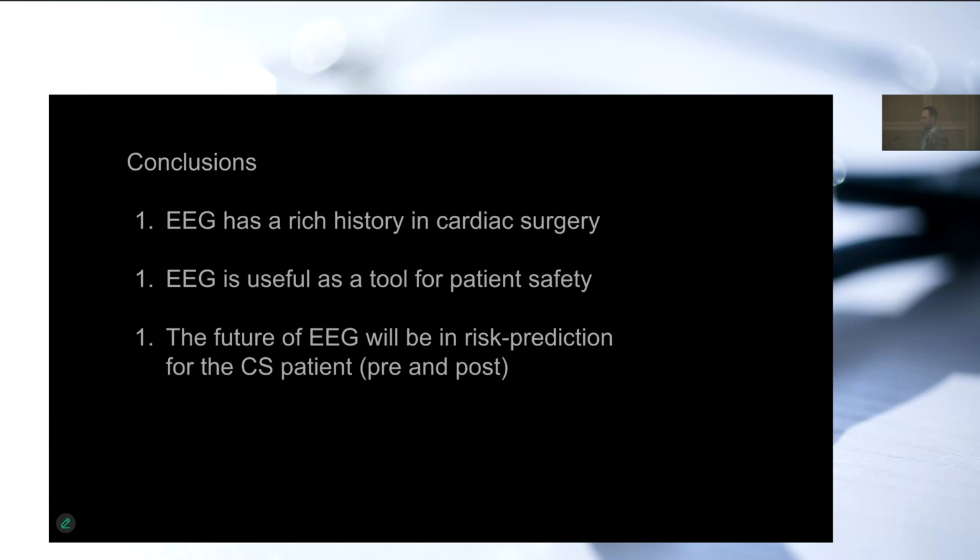I guess a quick follow-up question would be, is there any harm in overdosing somebody who doesn't have a predisposition to that? There doesn't appear to be. We do this in children all the time. There was a nice paper that was just published a year ago that looked at children undergoing MRI under anesthesia, which we do typically with propofol infusions in most large centers in the country, or in the world rather, but without EEG for reasons of signal artifact.